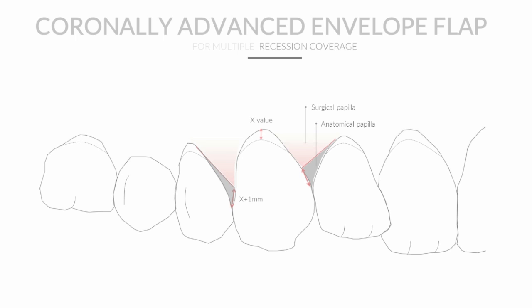We then proceed to the lateral incisor and transpose the recession value to its mesial papilla margin, which will serve as the end point of an incision starting at the apical margin of tooth number 11. We then repeat this procedure for the first premolar, transposing the recession depth values only to the papilla margin distal to the respective tooth.